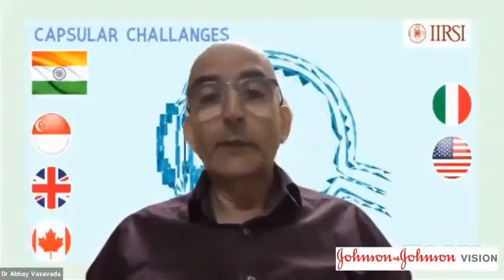Meaning, because these are chronic angle closure glaucomas, would the amount of adhesion that has taken place persist or not? I think that's very true. You're right. We have been following with all imaging technology possible, including gonioscopy, anterior segment OCT, UBM, all the stuff. The actual plastering of the angle depends on the function of the trabecular meshwork, but in 8 or more of the 10 cases, it works well.